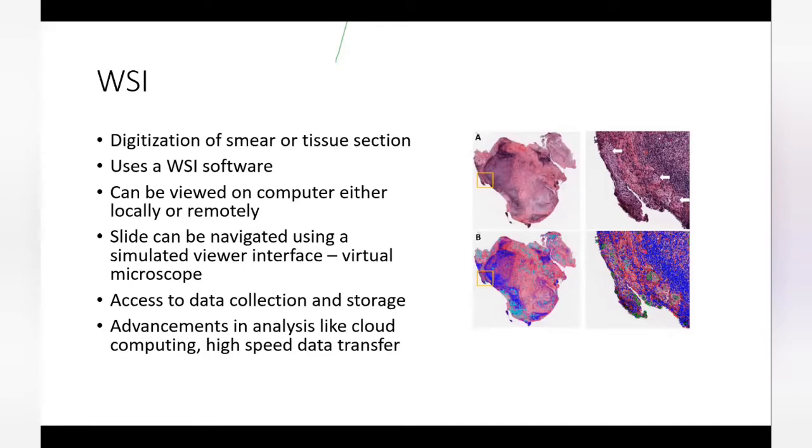So there is an immense use for data, and you'd agree that it's far better than storing these slides under horrible conditions with storage space issues in laboratories for 10 years, and the patient comes back after 5 years and wants you to somehow review or retrieve the slide for them, and you don't know where to look for them, or you can't find them, or you find them but they've lost their quality. So all of that is solved by this one particular feature that a software can provide for us.